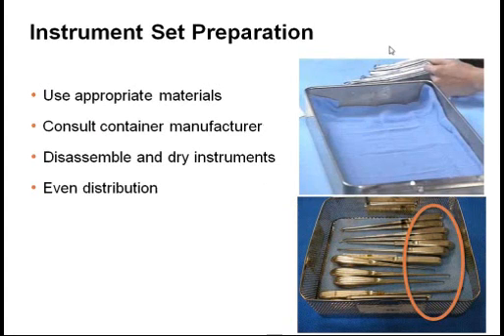When using tray liners, confirm the approval for appropriate sterilization methods. First, line instrument trays with an absorbent towel or disposable equivalent before arranging the instruments in the pan. Moisture formed during sterilization readily dries from absorbent materials rather than from droplets or pools on solid metal surfaces. Do not use water-repellent textiles, non-woven disposable wraps, or thick absorbent textiles to line the trays. Thick absorbent tray liners may pool or trap moisture, making it difficult to dry the set.